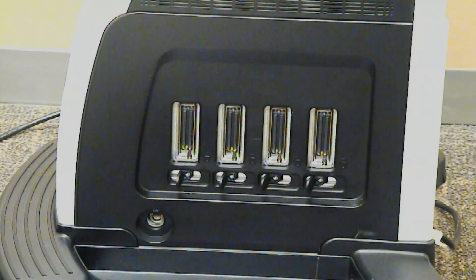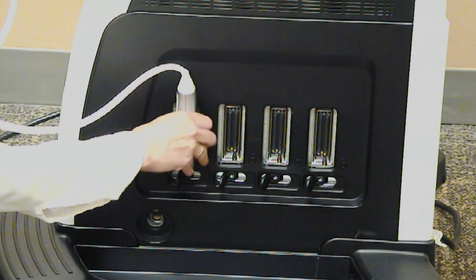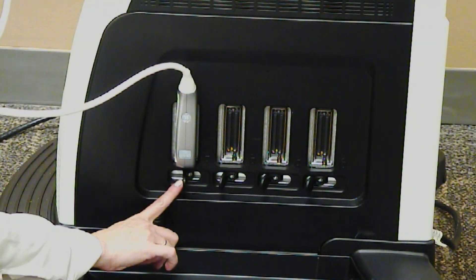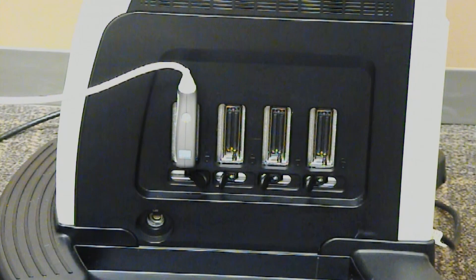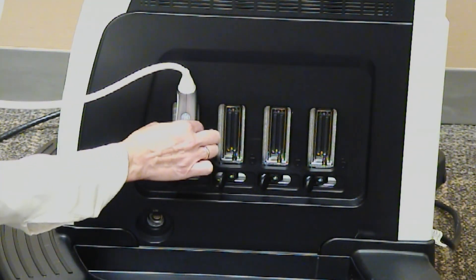Four probe connectors are located on the side of the system. To connect a transducer, push the transducer forward into the probe port, then slide the lever to the right. To disconnect, slide the lever to the left and pull the transducer straight out.